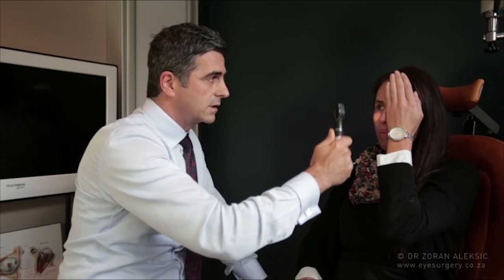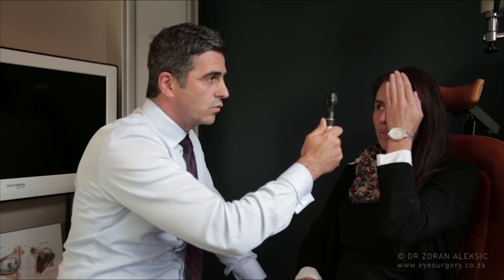And if, with a bright torch, the patient cannot see the light at close proximity, or any movement or anything else, we mark it as no light perception, or a blind eye.